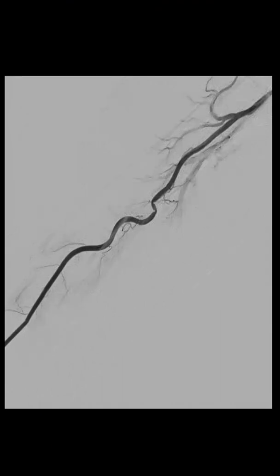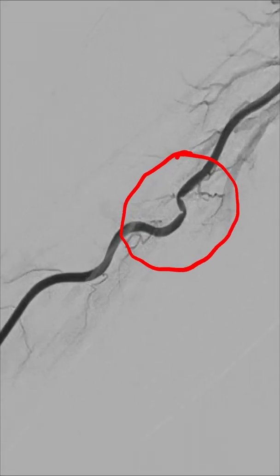Now we'll come to the patient who underwent a DSA through the radial route. What is this? Right radial. So this is one reason why we say always do an angiogram before proceeding further. Here what do you see? There is a small kink here. If you enlarge it further, you can see that there is a kink in the radial artery.